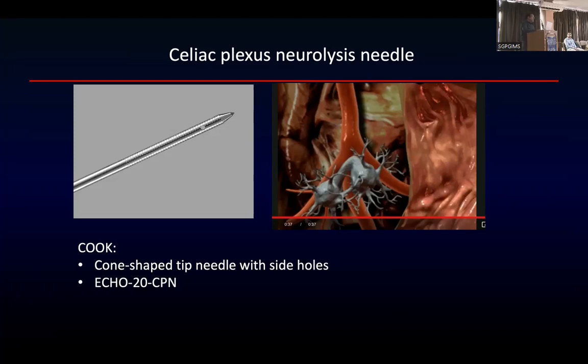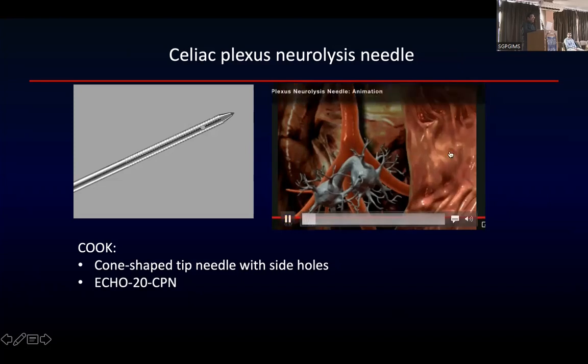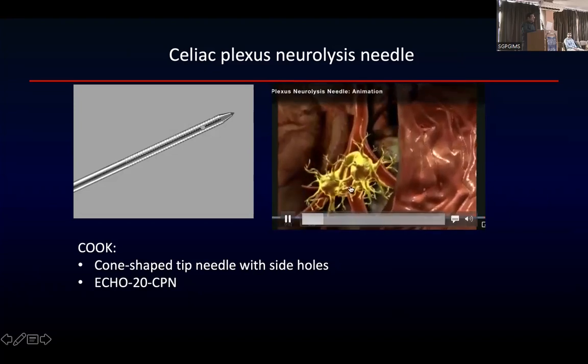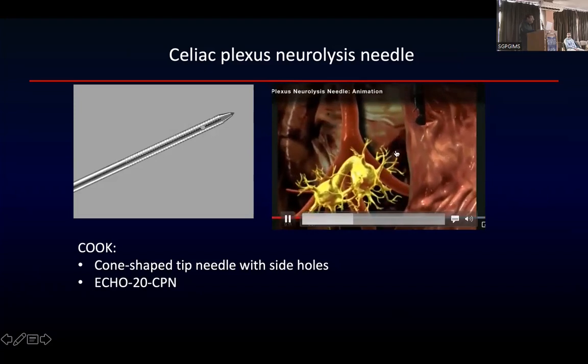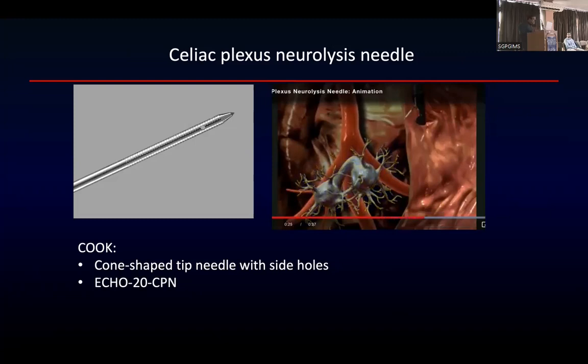If you just have an opening at the end, I'll play this animation video. So if you see this, this is an FNA celiac plexus neurolysis. This is what the celiac plexus looks like. You pass the scope, you puncture, you look for the celiac artery and inject at the level of the celiac artery where the celiac ganglion is located. And so you have the injectate delivered in the form of a shower. You can see this is the advantage of a celiac plexus neurolysis needle.